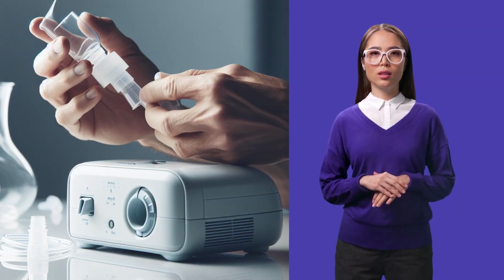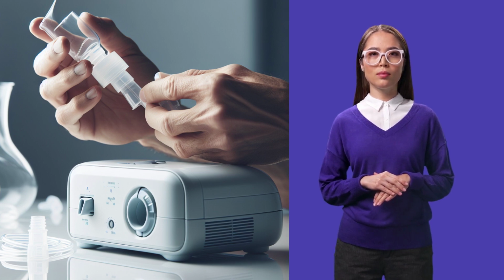Preparing the medication. First, let's prepare the nebulizer. Wash your hands to ensure hygiene. Verify the patient's prescription for the correct medication and dosage. Use a sterile dropper to measure the medication and pour it into the medication cup. If needed, add sterile saline solution to dilute the medication.